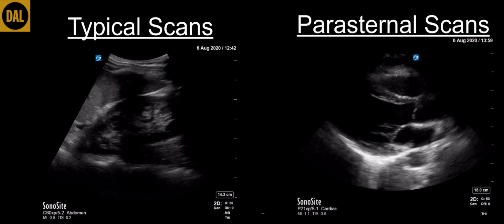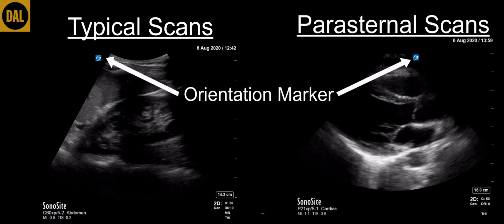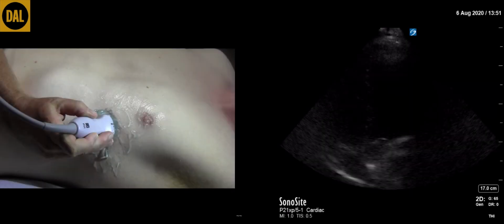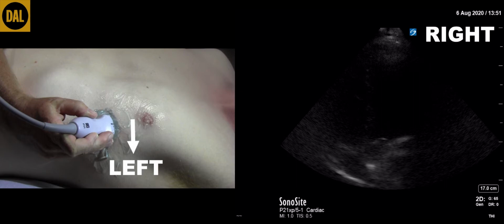the cardiac setting results in the screen orientation marker being on the right of the screen. Once again, don't panic. This orientation is just convention for cardiac scanning. For this scan, the transducer orientation marker is now pointing towards the patient left. Screen right is therefore patient left.